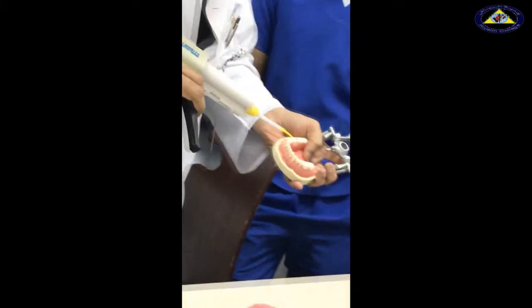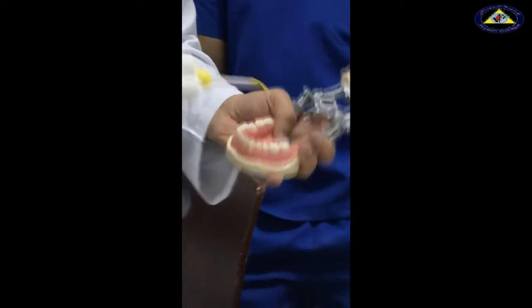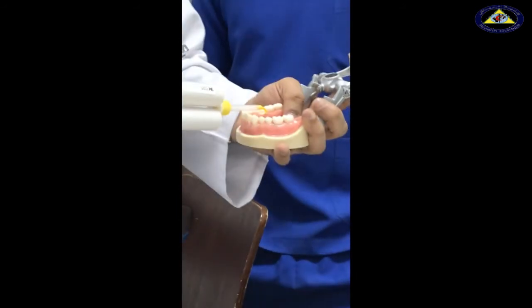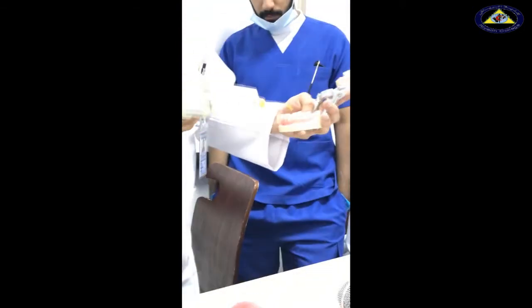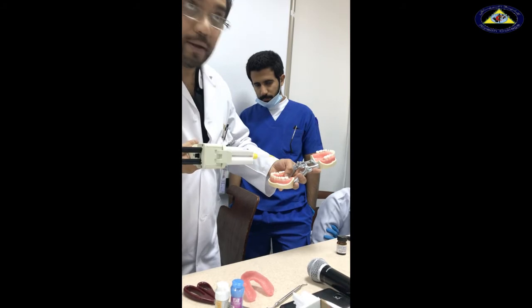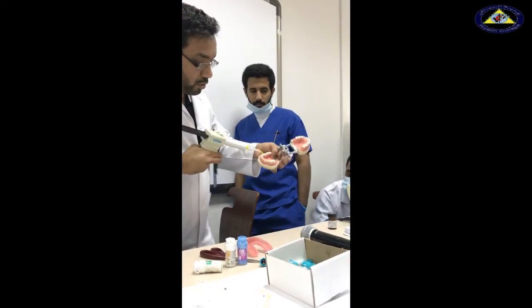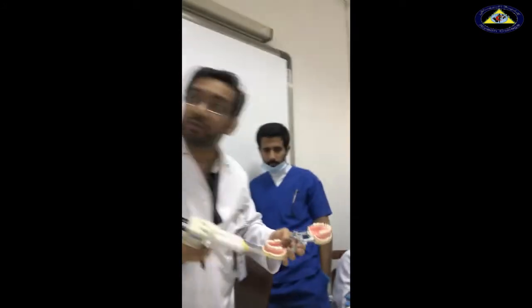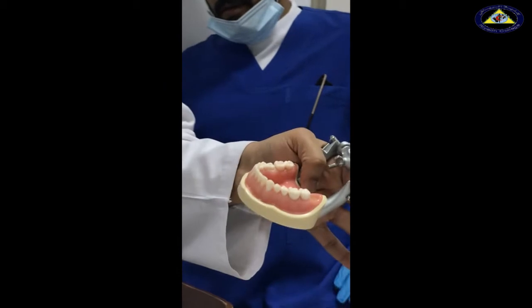Once I'm sure the material is coming to the lingual side, I keep injecting along here, then bring it to this side and inject along the finish line. The finish line is extremely important — never take it away. Then start painting the axial walls, all the axial walls, the occlusal aspect. The tip should be touching at all times. Then go on to the occlusal aspect of the adjacent teeth.